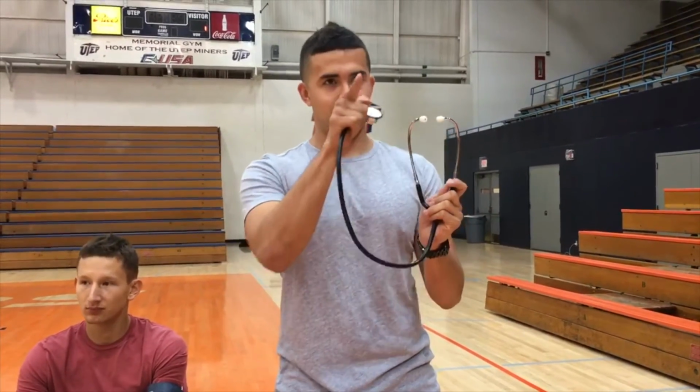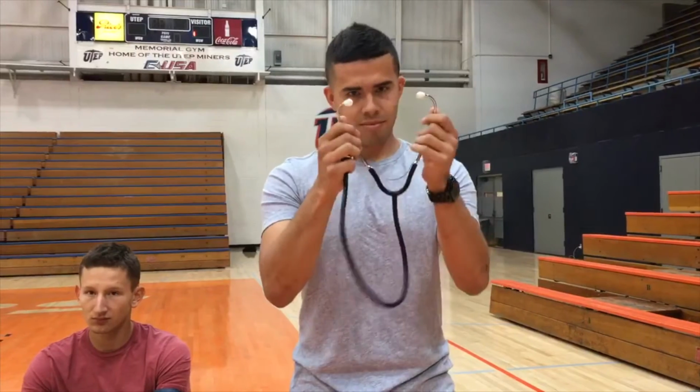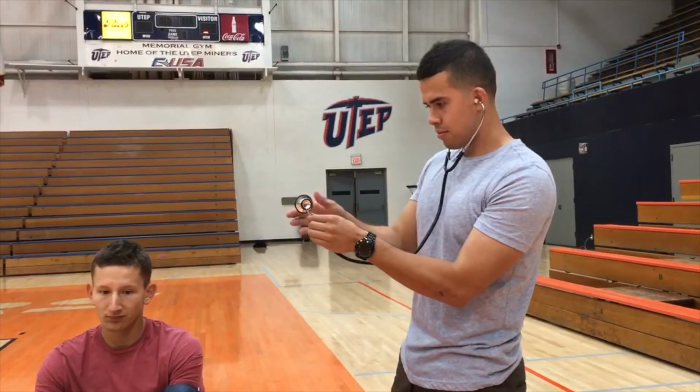When looking at the prongs on the stethoscope, it is very important that the earpieces are pointing forward and not backward, as you will not be able to hear anything if they are pointing the wrong direction. We take the bell and tap on the diaphragm to make sure it's on. If not, we twist the bell to the on position.